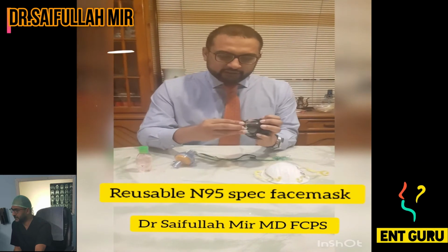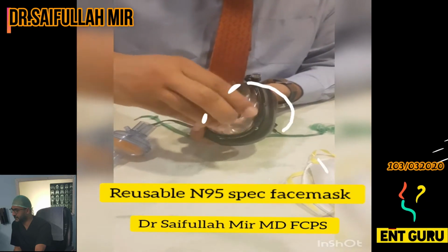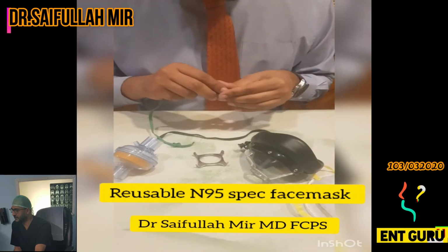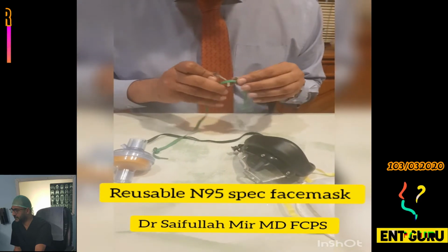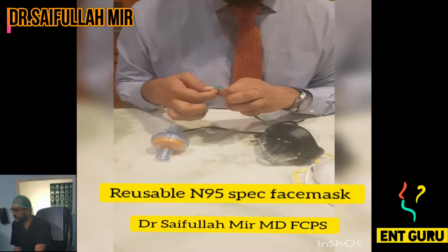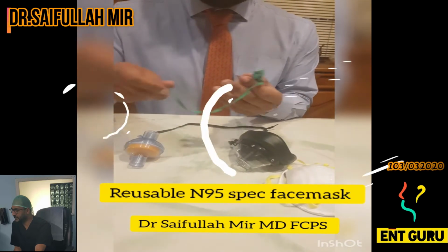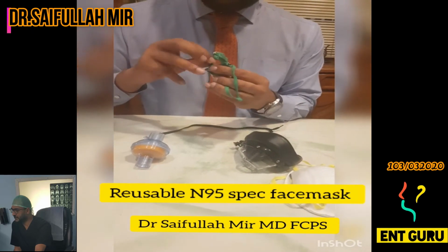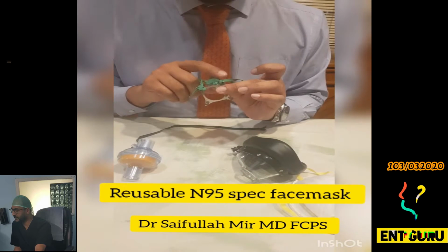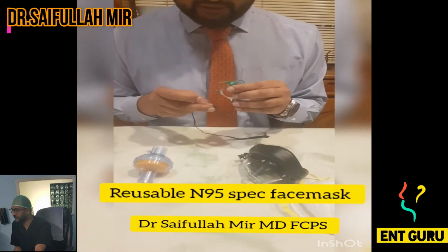So you take out the rubber connector and take out the metal hook. Okay. Now you take these strings. As I've done a lot of demonstrations, there are some knots on it, and you tie a knot, a second knot, as such. Okay, now coming to the adjacent one, you have to tie another knot. As you can see on one and two, I've tied a light green string with knots. Knots to the bottom string, okay?